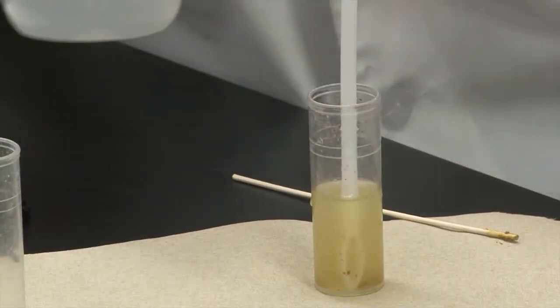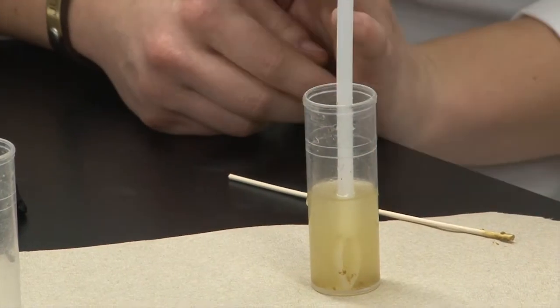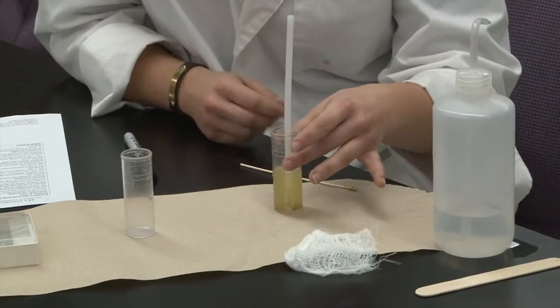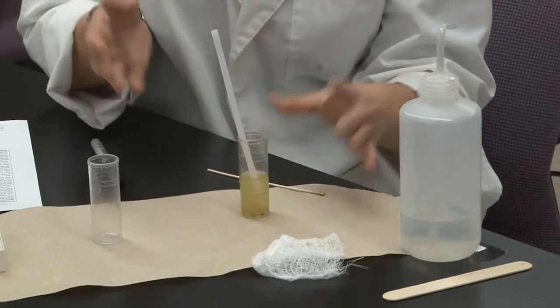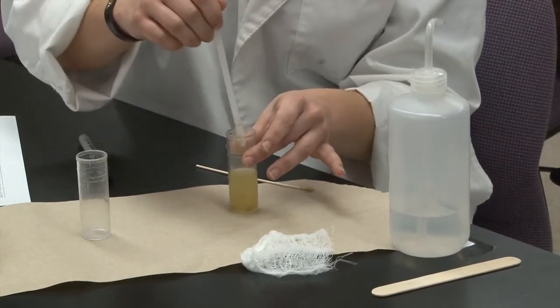This is a dog sample, so there's not a lot of debris in it. But if it had come from a ruminant like a cow or a goat, or even from a horse — an animal that eats a lot of hay — you'll see lots of big chunks of debris in your sample. So you're going to want to get rid of that.